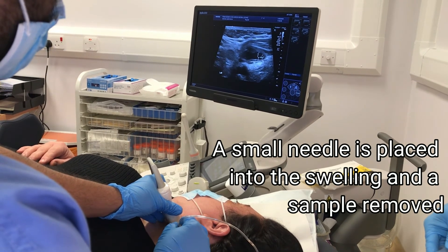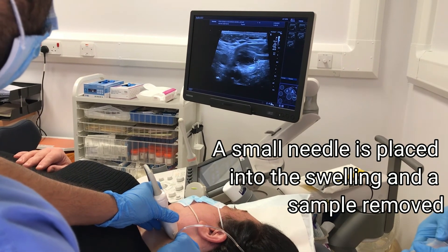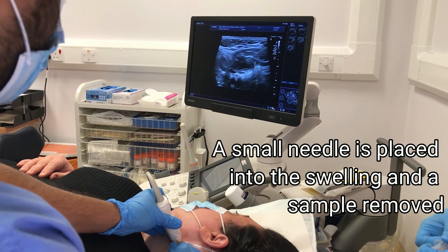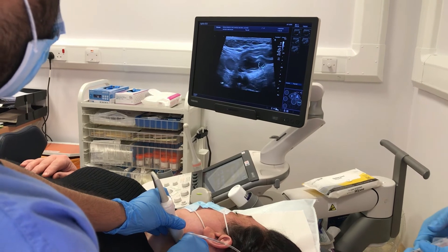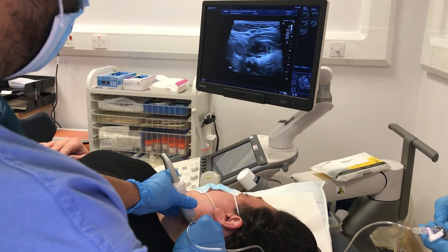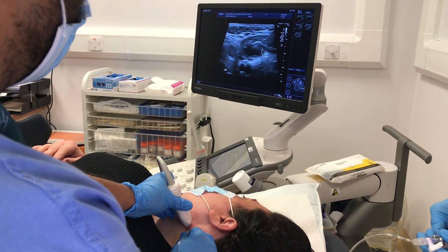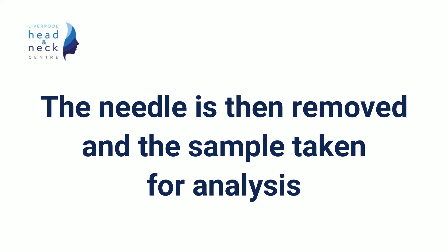Once they are happy with the position, a small needle is placed into the swelling and the sample is removed. When this happens, there will be another clinician in the room to help the person performing the biopsy. The needle is then removed and the sample is sent for analysis.